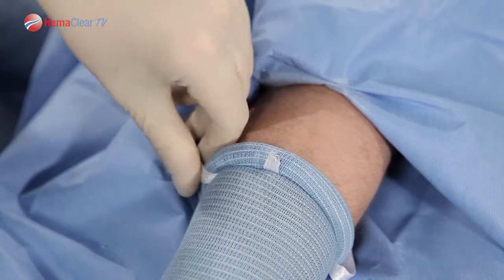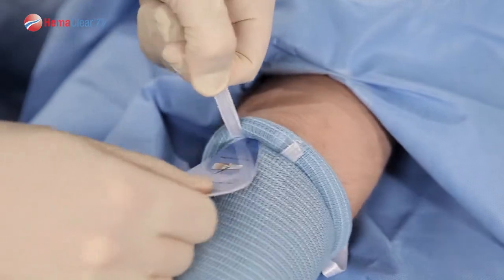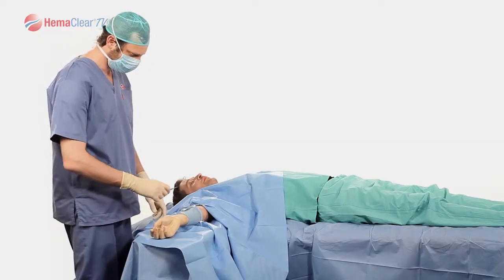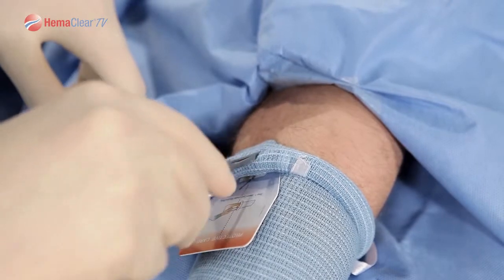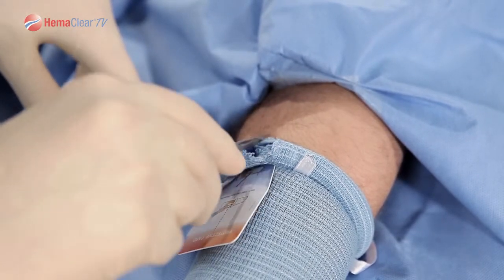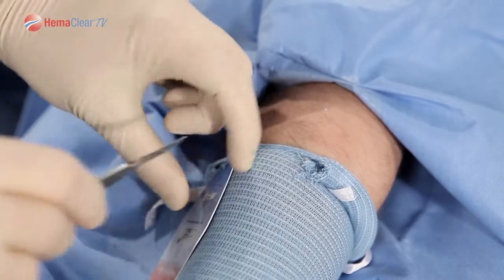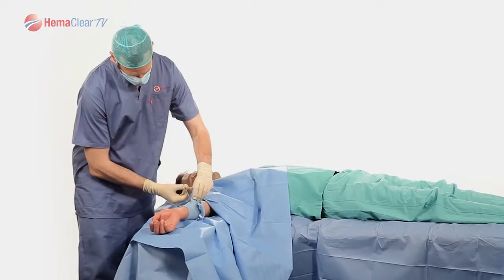When you would like to remove Hemoclear, place the Hemoclear cutting card from the distal side of the ring under the Hemoclear. Utilizing a knife, cut the ring in slow, orderly passes. Once you are through the internal silicone ring, you can utilize scissors to remove the rest of the device.